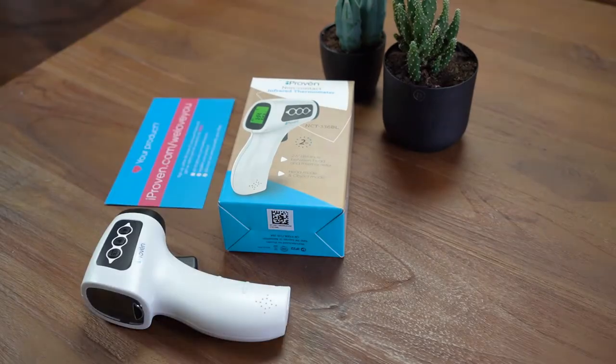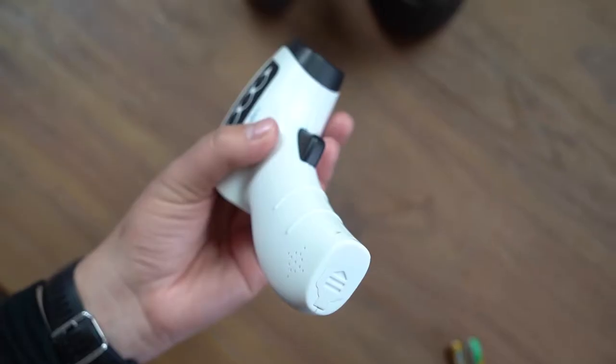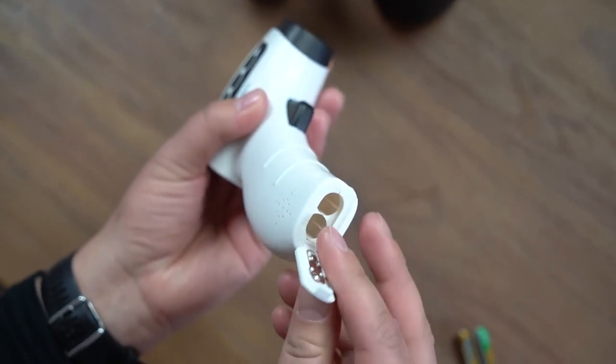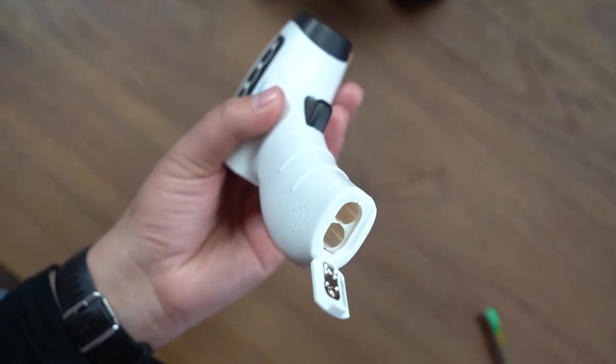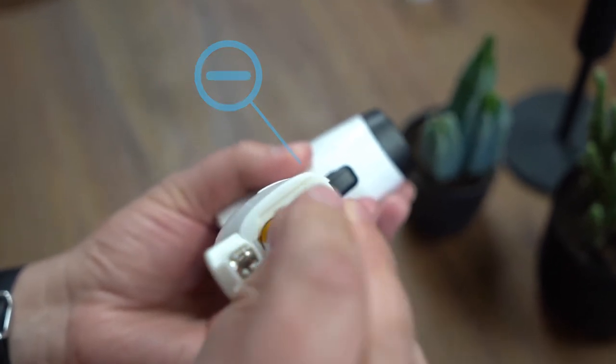With the no-touch thermometer, you'll receive a set of batteries and a user guide with clear instructions. Get the forehead thermometer ready by sliding open the battery cover, and insert the two AAA batteries according to the plus and minus.